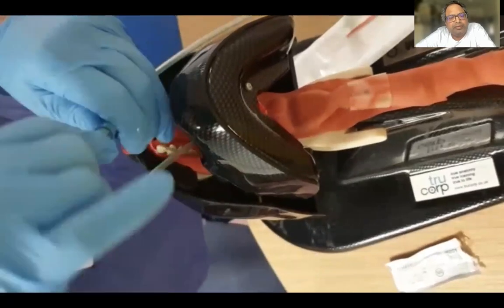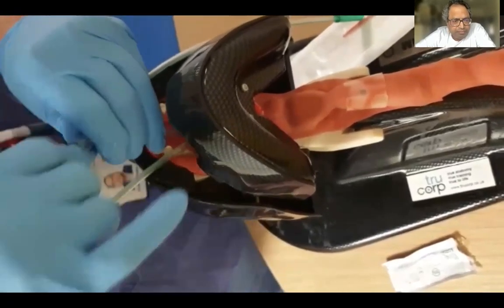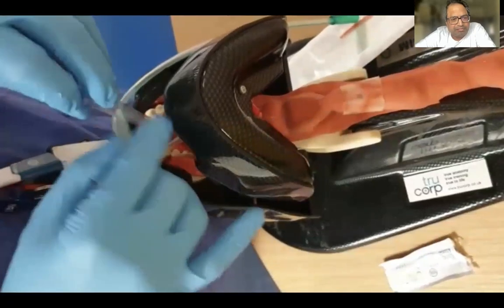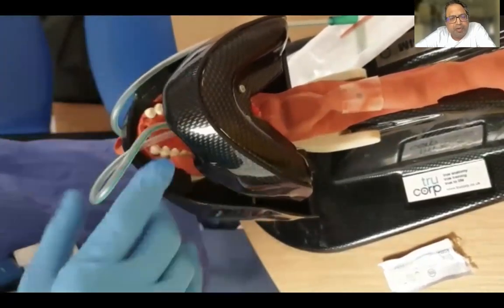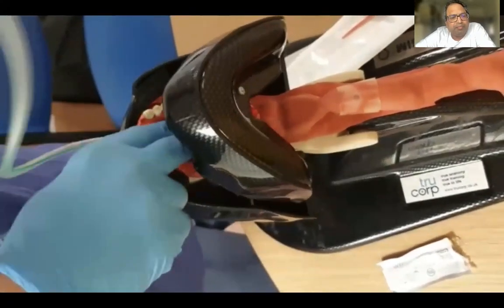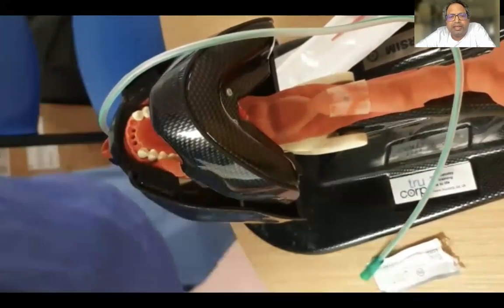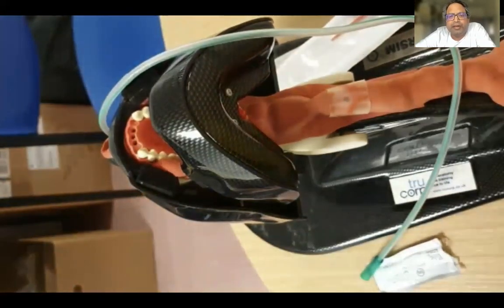So let's say I'm drawing it up and then pushing it up all the way. And then the slit will actually come out. So it'll come out through the slit. You just bring it out, and keep hold of one end, or you can keep pushing it and pull out the other end so that it's nicely in place. So that's all done. So that's how we use the split endotracheal tube for NG insertions.